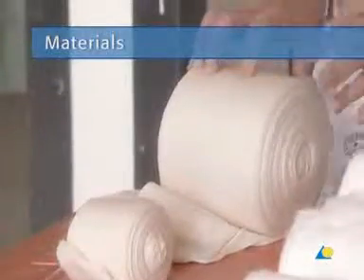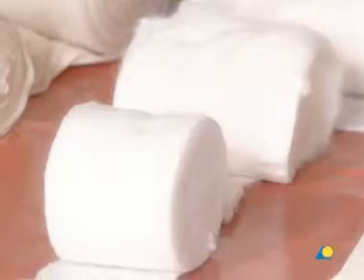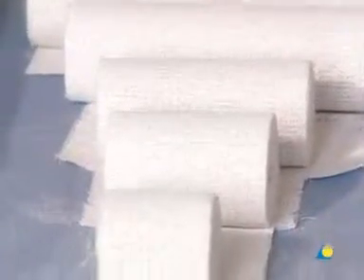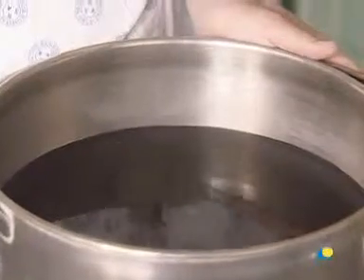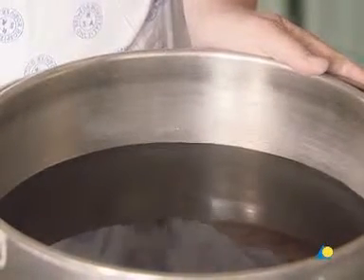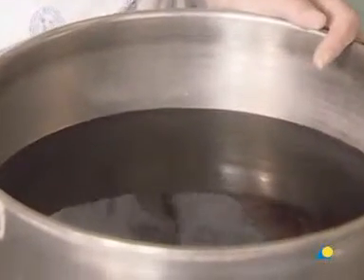To apply the thumb spica, the following materials are needed: a stockinette or tubular gauze bandage, cotton wool for undercast padding, scissors, plaster of Paris bandage available in rolls of varying widths, and water or another wetting agent. The water should be tepid or lukewarm, ideally between 22 and 25 degrees Celsius. Colder water or a wetter bandage allows increased working time, while warmer water or a drier bandage reduces working time.